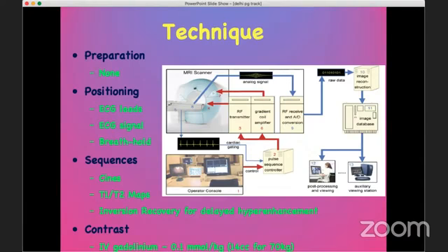We like to prepare our patients one day before by telling them about breath holding. Here, you don't need to take a deep breath. It's just holding the breath for the various sequences. There are about 30 to 35 sequences in a typical MR data set, so good breath holding really gives us good quality pictures.